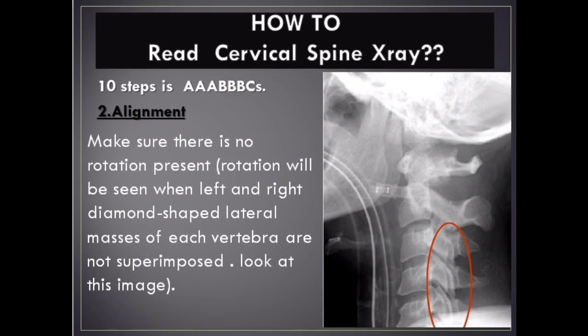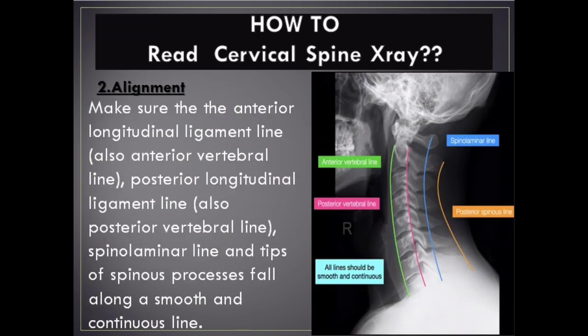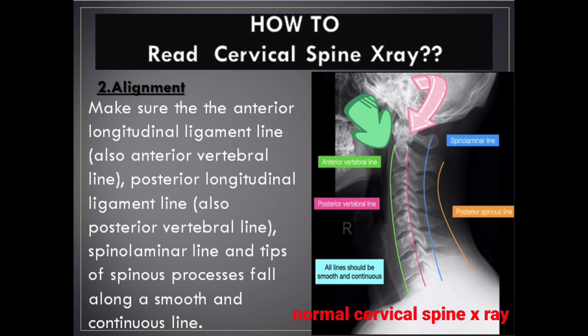Step 2 – Alignment: Make sure there is no rotation present. Rotation will be seen when the left and right diamond-shaped lateral masses of each vertebra are not superimposed. Make sure that the anterior longitudinal ligament line, posterior longitudinal ligament line, spinolaminar line, and tips of spinous processes all fall along a smooth and continuous line.